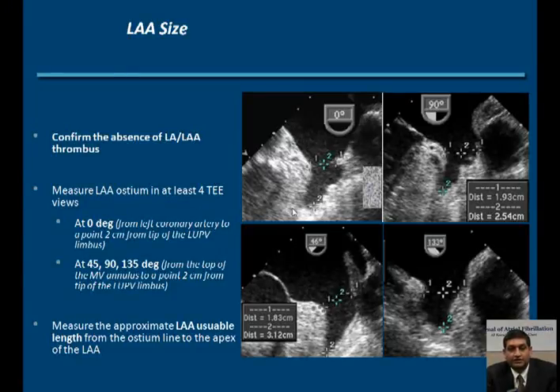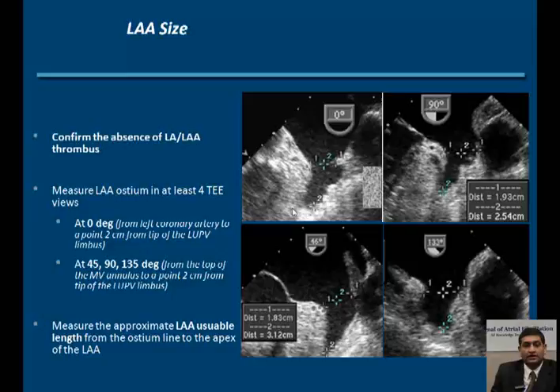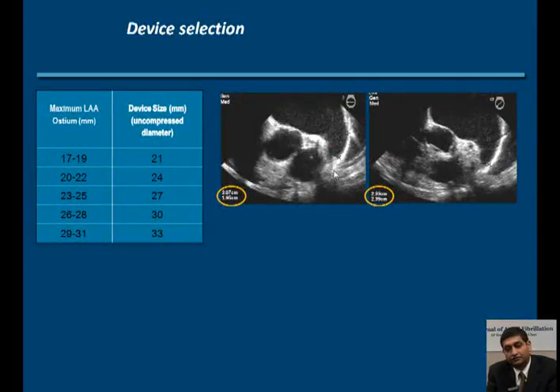76% of the randomized patients discontinued Coumadin or warfarin at 45 days. 87% of the implanted patients discontinued warfarin at 45 days. At 6 months, the number was higher, at 92%. At 12 months, 93%, and thereafter it stayed around 93 to 94%. The reasons for continuation or reinitiation of Coumadin remained between physician discretion for other risk factors and observed flow around the left atrial appendage.